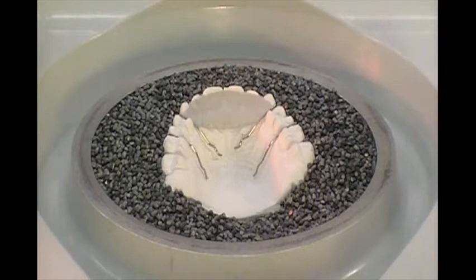Sweep excess pellets with a 1-inch brush. Pellet level should be against the occlusal tooth surfaces and heel of model, and extend to the rim of the cup. Make sure the pellets are removed from the cup's rim.